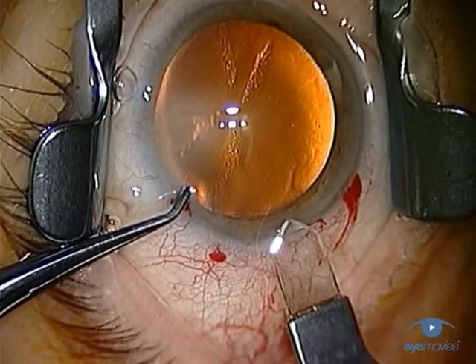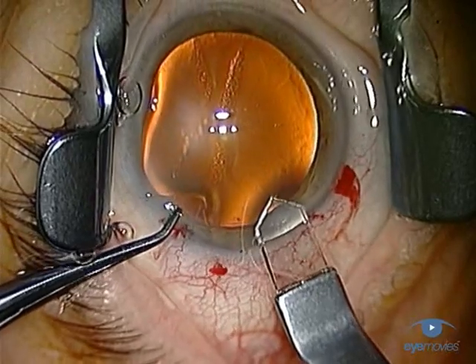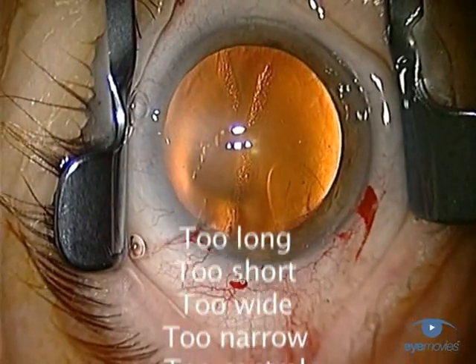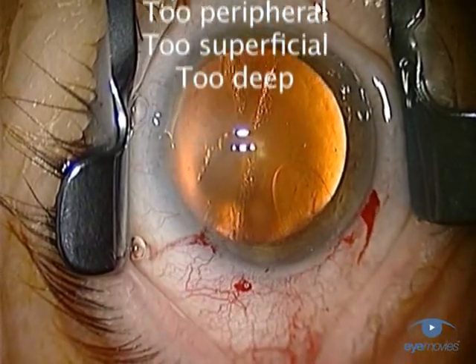The main incision is the very first surgical step in phaco, and it's an important one, because all the subsequent steps depend upon its correct construction. Get this wrong, and there are many ways in which you can do so, and you'll spend the rest of the operation paying the penalty for it.